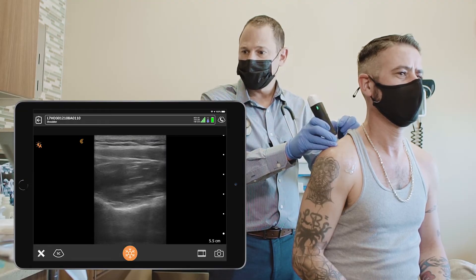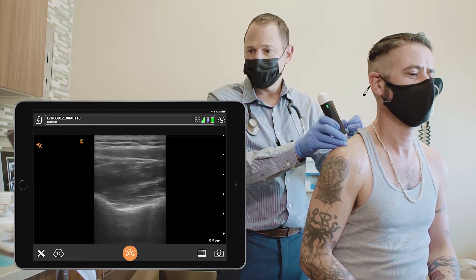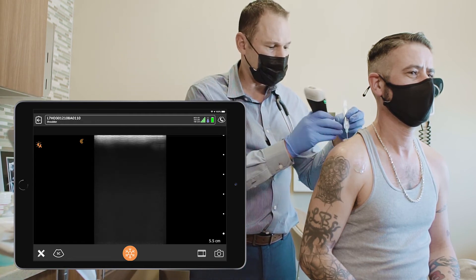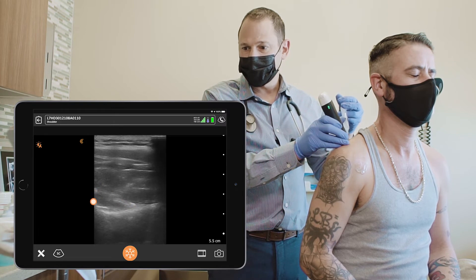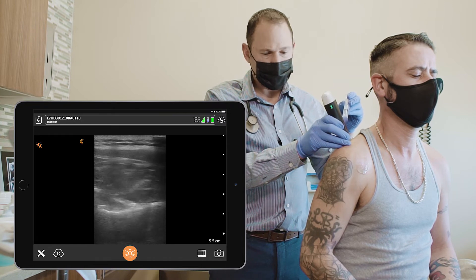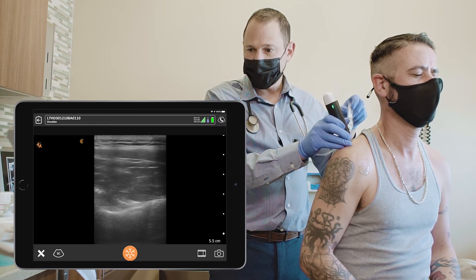You can see the needle coming in. I'm approaching the region of the nerve, back on the ligament. You may feel some pressure in the shoulder while we're working. I'm doing a little anesthesia above the ligament, then pulling back the needle to take a different angle and get more proximal. I'll pierce the ligament again to move a little further from the nerve and still get the anesthesia in the proper location.